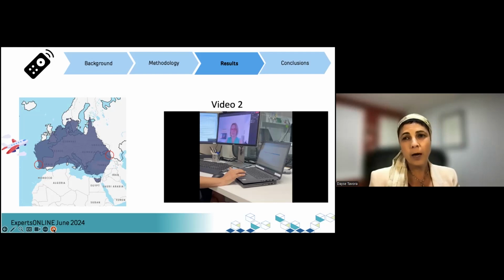As I said, in our centers, what we have is this system where the patient receives a video call. We use this as a standard of care. So it's a video call. The patient is in front of the screen, as long as they have a computer, anything, or telephone. They have the video call with us, and we do that using the sound processor. So it really complements our service.